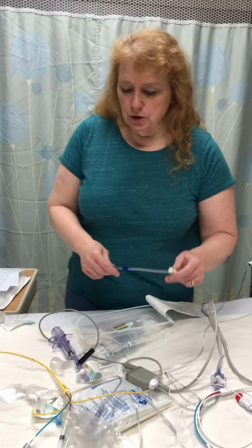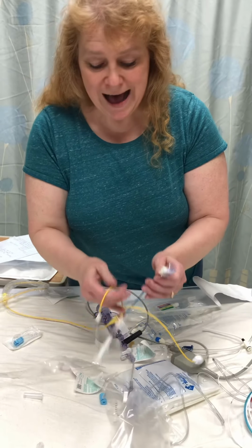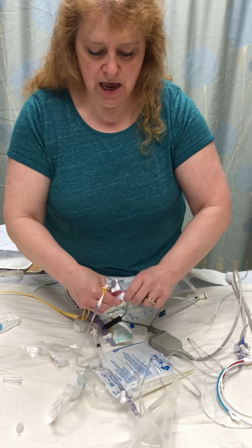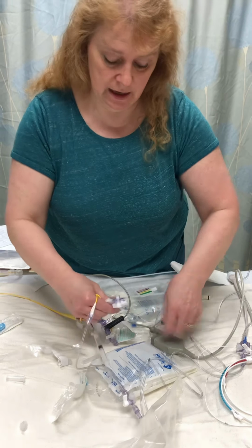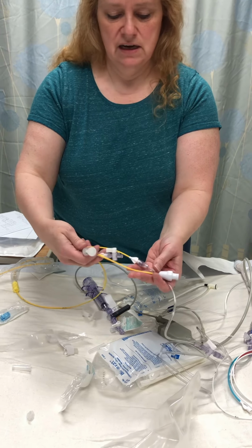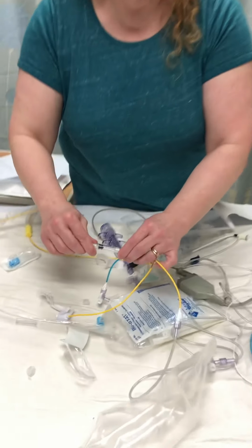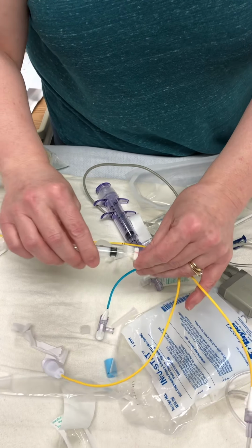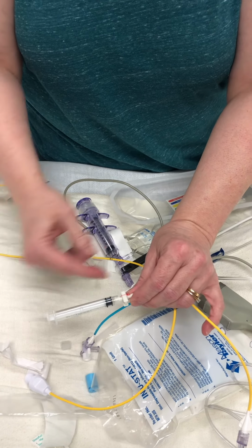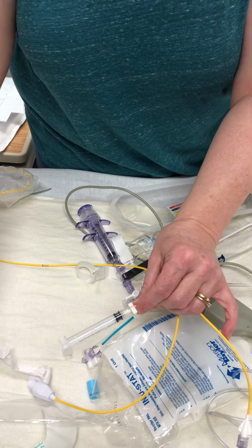The couple other things that I've found helpful, just so they don't get all mixed up: I disconnect everything from my swan and make sure the stopcocks are off so you don't inadvertently get air in there. So basically it just looks like it's on the patient like this. Disconnect everything, stopcocks. You want to make sure the balloon is deflated. This is in the lock position, this is in the open position, and you want to make sure that when you put it in the open position, air doesn't come out.